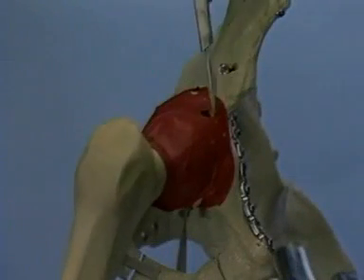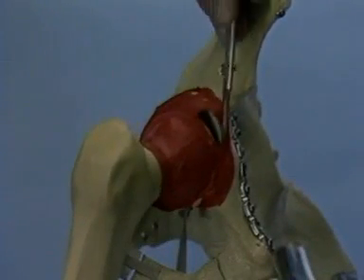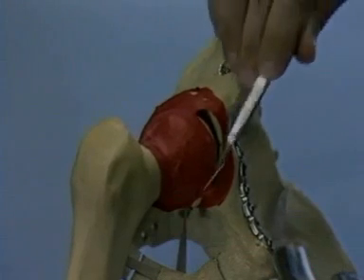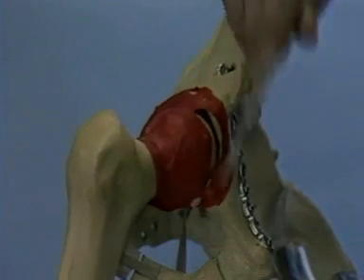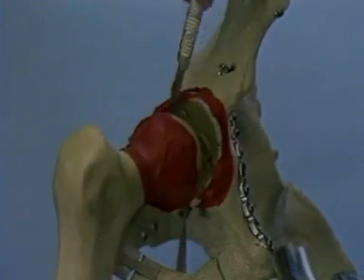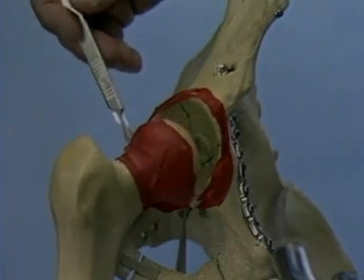The final reduction of the articular surface cannot normally be directly visualized. However, for this exercise, we will open the hip capsule to visualize the articular reduction.